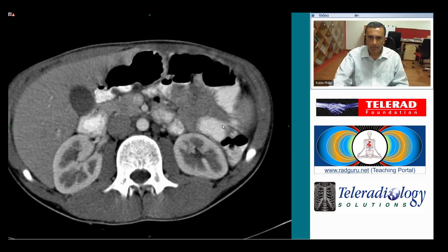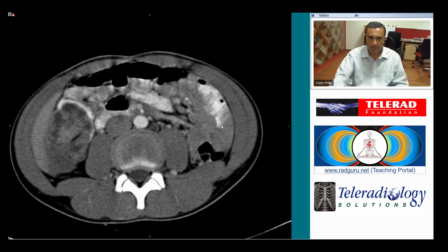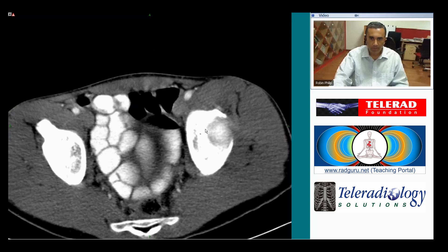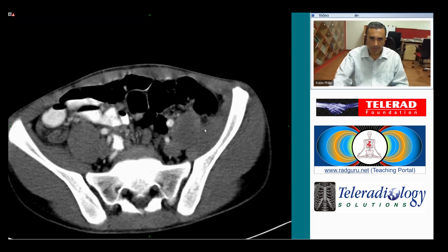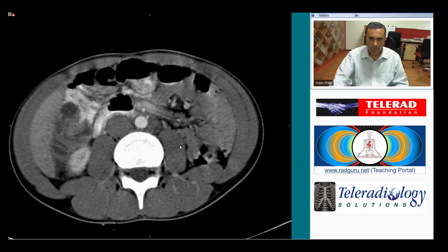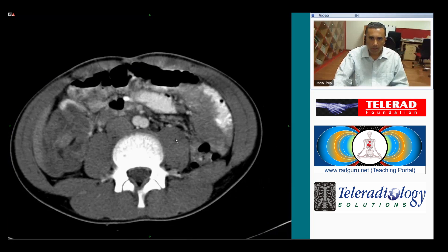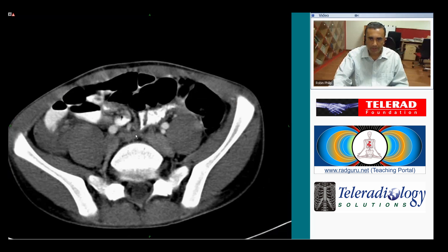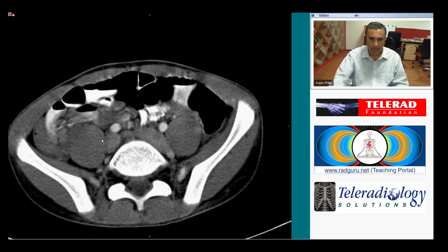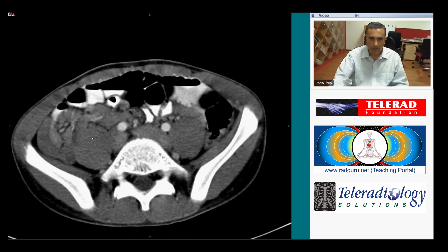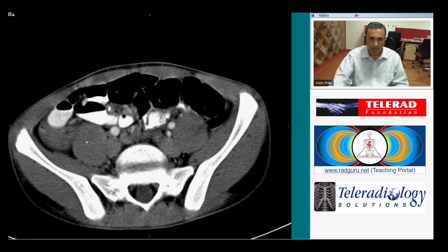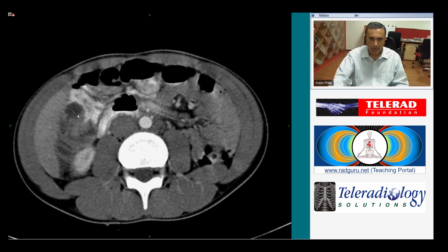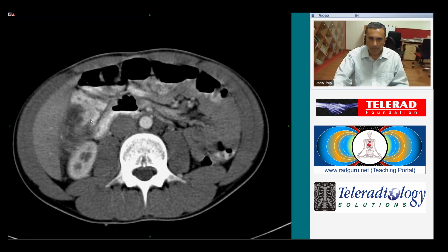Here is an example of a young patient presenting with right lower quadrant pain with suspected appendicitis. When we scan through the abdomen, the obvious finding is this soft tissue mass in the right flank and right lower quadrant, which tracks all the way from the cecum down to the hepatic flexure of the colon.